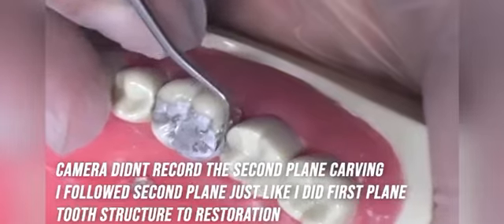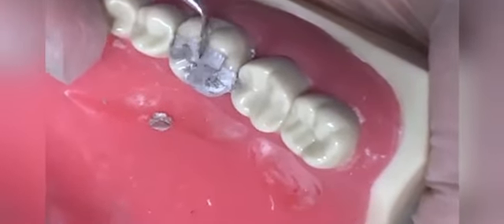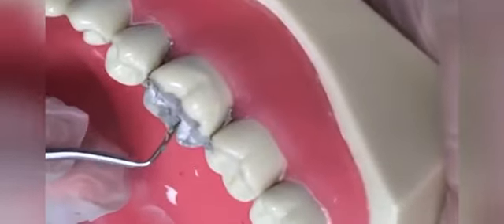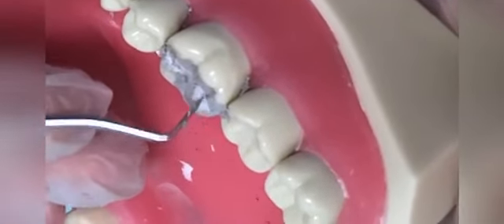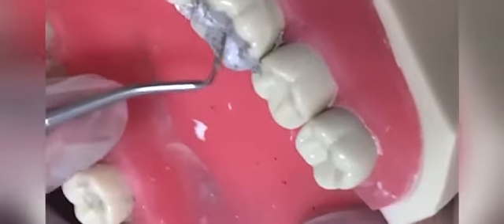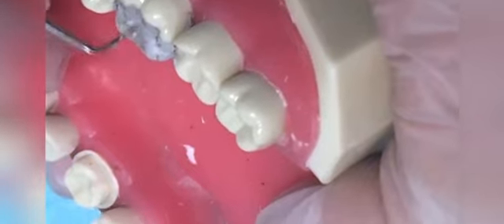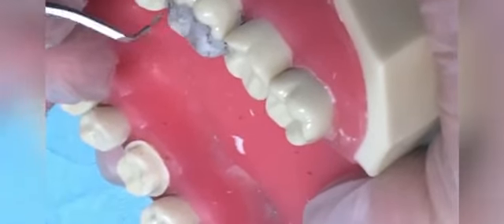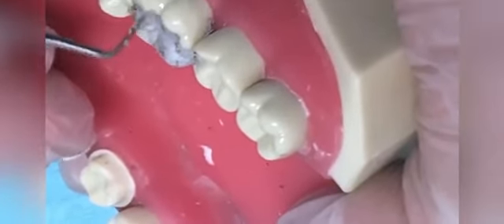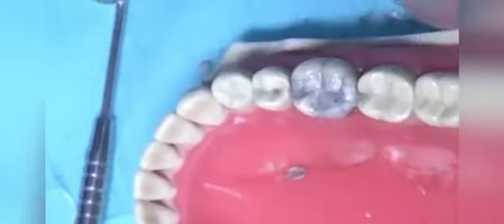Just remember that while you are doing the carving, the amalgam should not be set, it should be in a carvable stage. Here we are creating the cusp, so we are working at an angle of 45 degrees, and on both sides we are sweeping off the extra amalgam. So it will create a high portion in the central and a depression on the sides. So we are almost there.